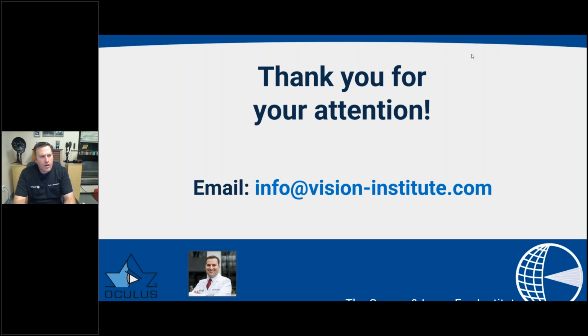So I don't really use chord alpha that much. I really use chord mu and angle kappa. That's my main parameter I look at. And I use about 0.4 on the chord mu as a general cutoff for when it's getting large and when it's not. I'm certainly more concerned about it with multifocal lenses than with the EDOF lenses.